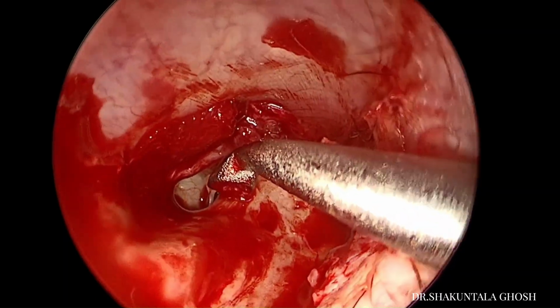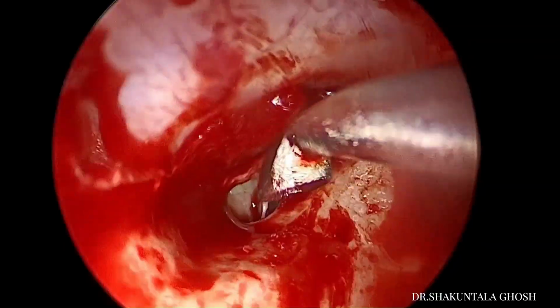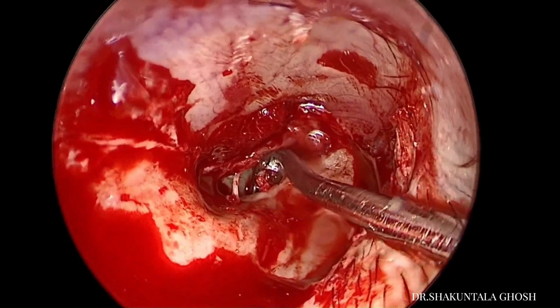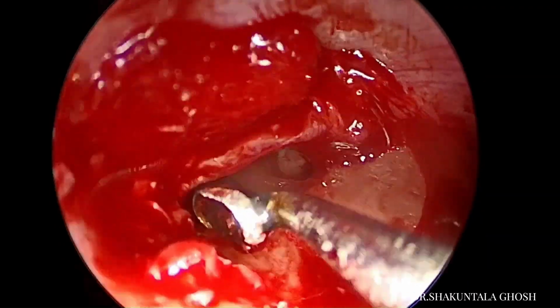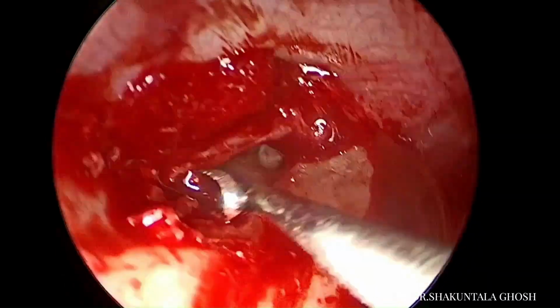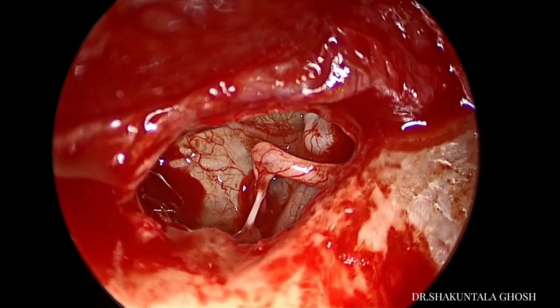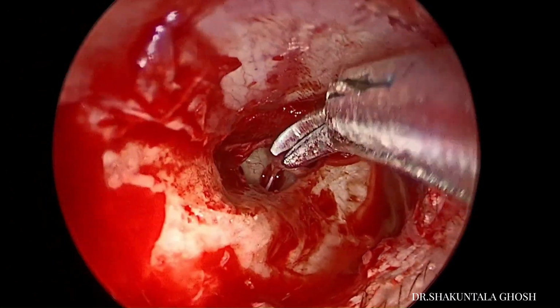Now I am curetting the posterior superior bony wall from the notch of Rivinus and coming down posteriorly so as to see the pyramid of the stapedial tendon. So that is the lower limit of the curettage. So one must be able to see the pyramid of the stapedial tendon very well, and the IS joint and the footplate and the horizontal part of the facial nerve. So these are the structures which should be well visible, and that will determine the extent of the curettage. So after that I am able to see the footplate very well, stapedial tendon, the pyramidal process, stapes suprastructure and the incus.